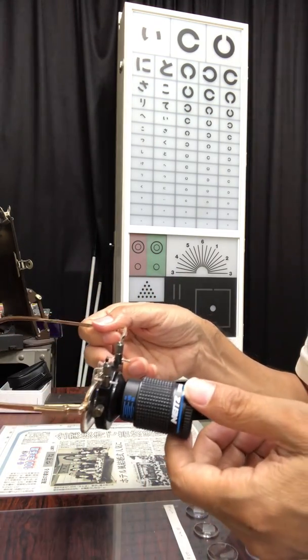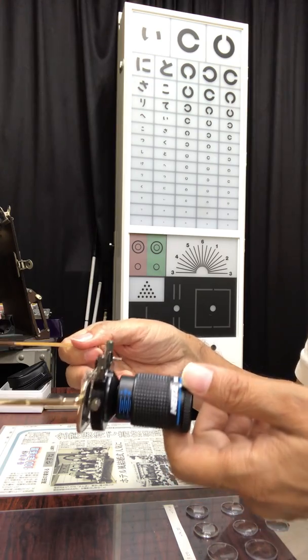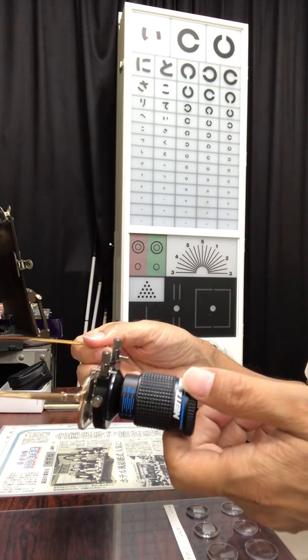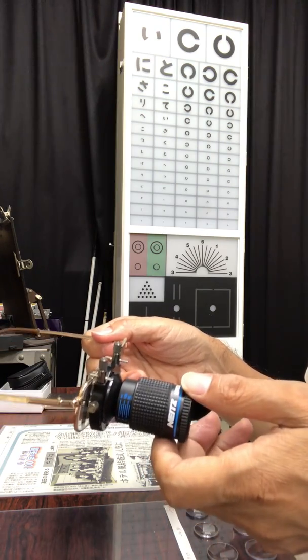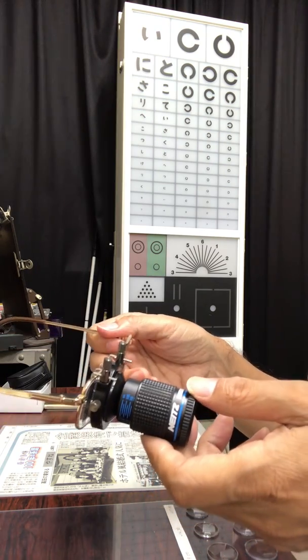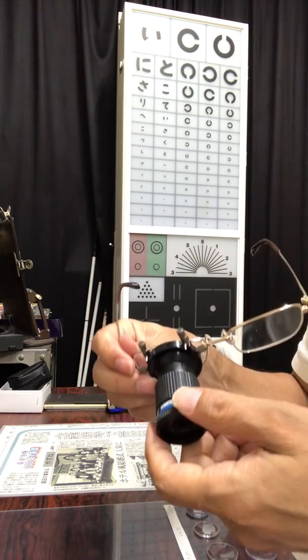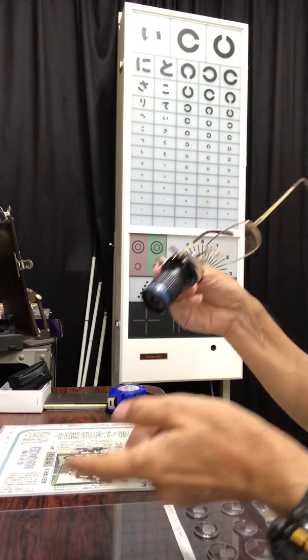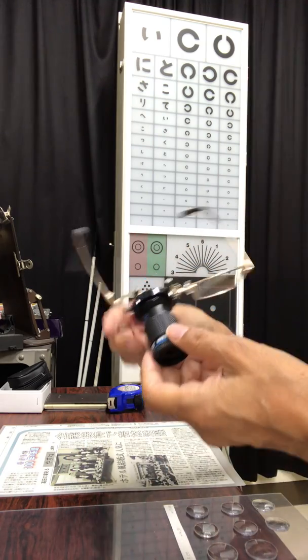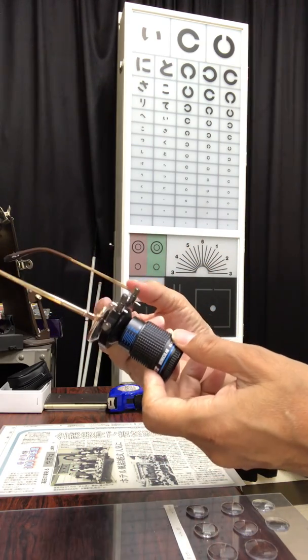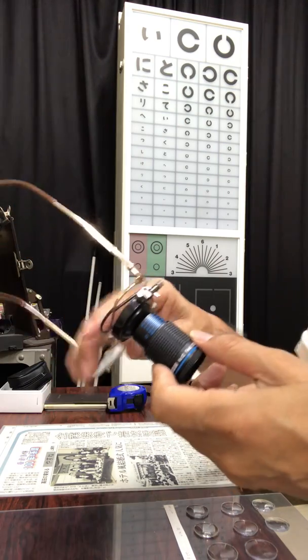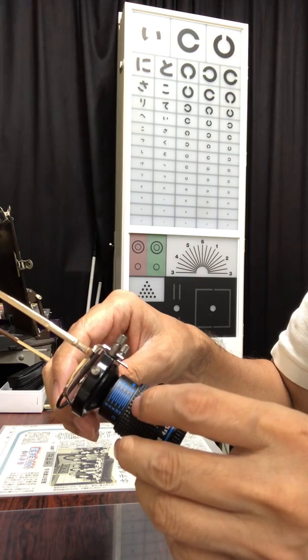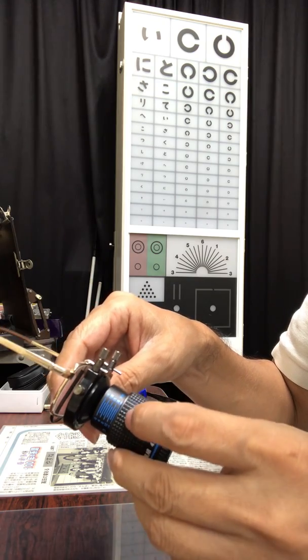This is a telemicroscope eyeglass for low vision people to enlarge the letters of newspapers which has long working distances. Now, I want to choose 16 diopters and a working distance of 13 centimeters.